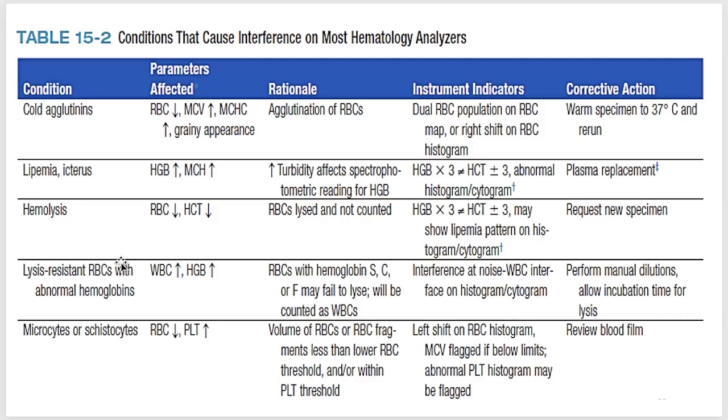Since hindi siya malyse, therefore, nababasa siya sa ating machine as WBC. Kaya tumataas ang ating WBC. Of course, your hemoglobin parameter will also be affected, causing an increase of your hemoglobin. So, how do you correct such problem? You perform your manual dilution or allow incubation time for the lysis.